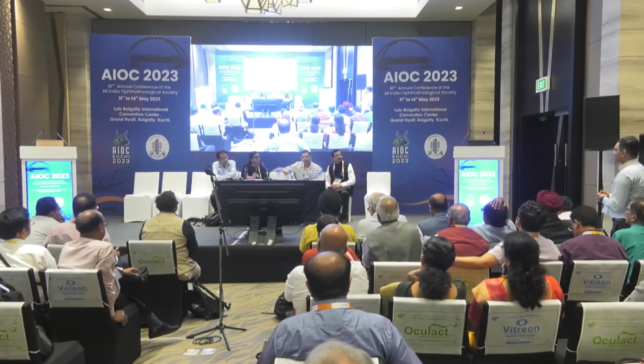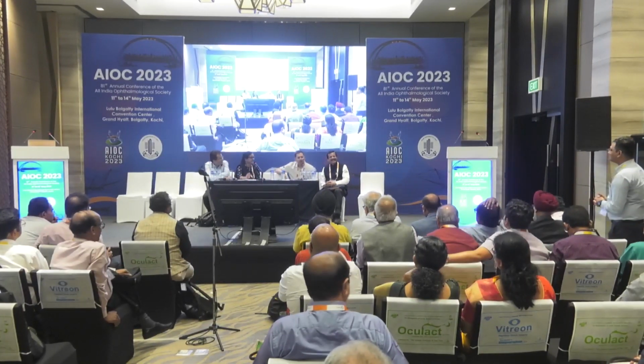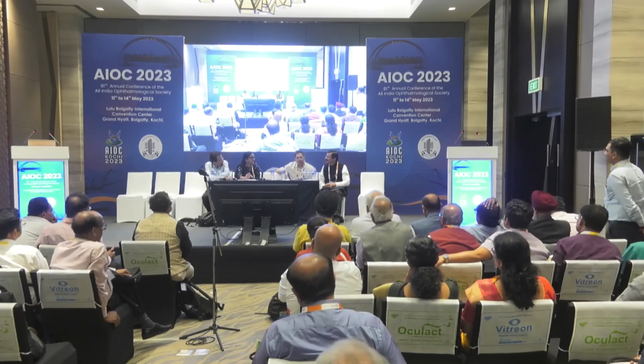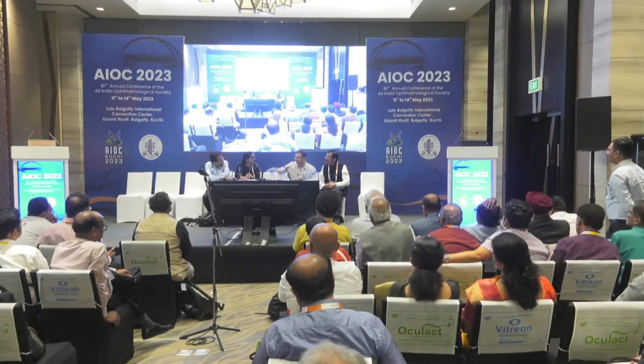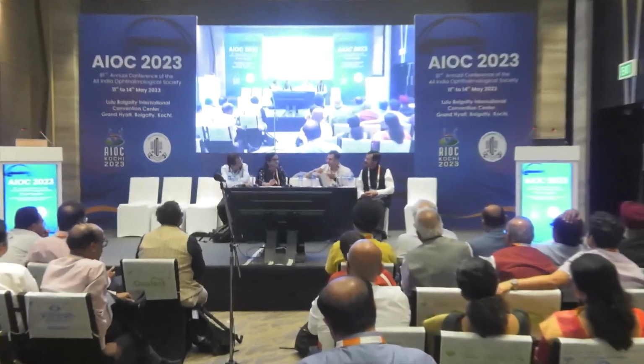It will be there. Don't worry, it will take care. I had one of my fellows who made this mistake of not diluting the triamcinolone, and there was a little bit of air in that 1 cc syringe. When there is air trapped in any syringe, when you press, the fluid will pass suddenly inside. So that is one thing to avoid. And he pressed it, and the triamcinolone just jettisoned in, and that patient had steroid induced glaucoma.